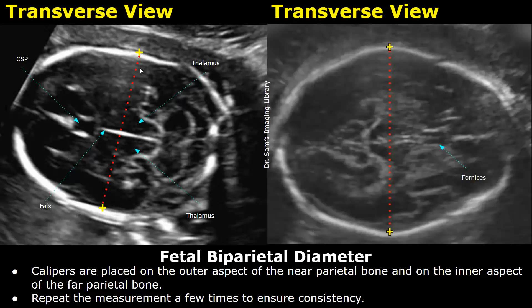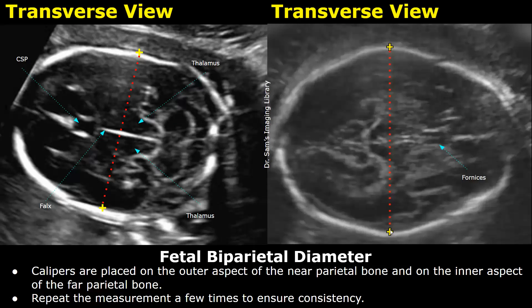Place one caliper at the outer aspect of the near parietal bone — place it right outside the hyperechoic parietal bone — and place the second caliper at the inner aspect of the far parietal bone, right at this point, and you will get the value of BPD. So one caliper on the outer aspect and the other at the inner aspect.